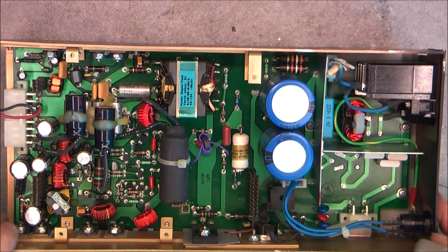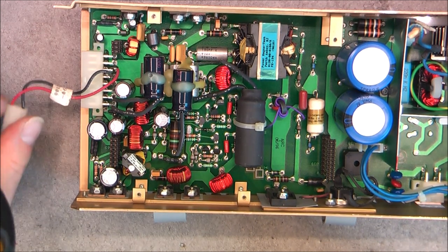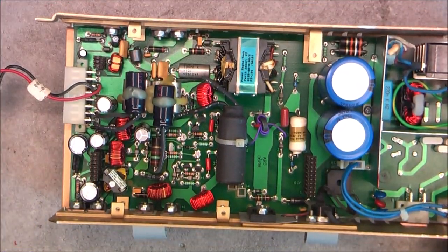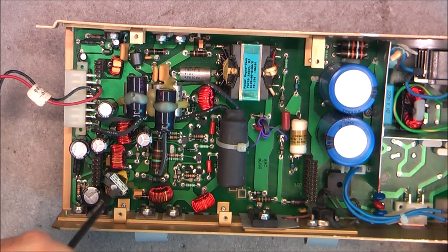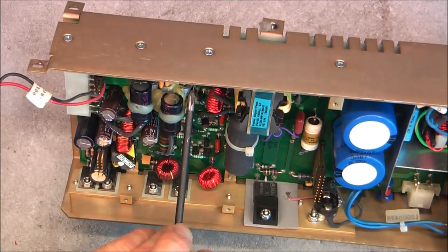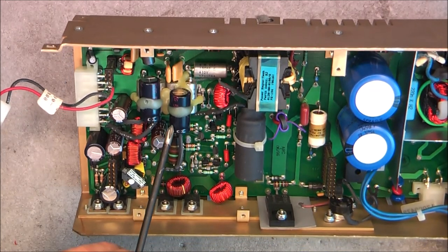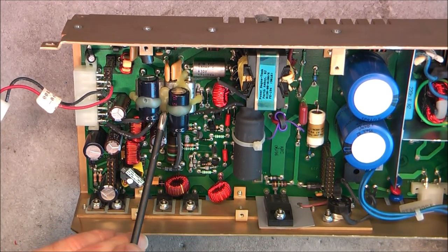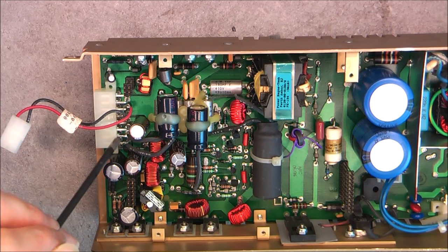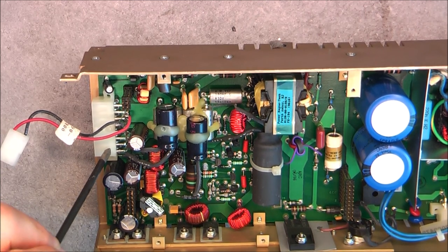Interesting, and look what we have here. So apparently the power resistor was plugged into this connector because they did solder the wires here at the back of the main output connector from the power supply. We have a lot of little coils, but look at this. It looks like they did use tantalum capacitors here at the bottom, mil grade, shielded capacitors, and for some reason they had to add extra electrolytic capacitors, this one being directly connected in parallel to one of the outputs of the power supply. So for extra smoothing of the output, something like this.